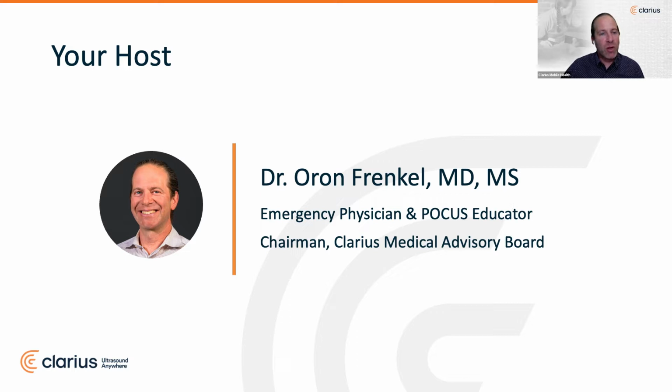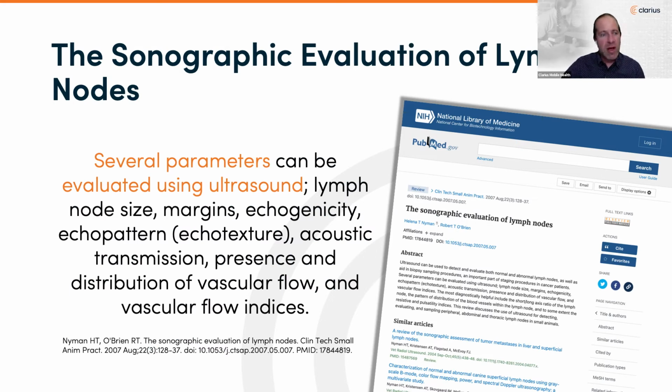To jump in, we're going to set the stage for today's discussion with a quick review of the literature. Start with an old review paper that shows what we'll discuss in this webinar, how ultrasound really is integral to the evaluation of lymph nodes, and not only to diagnose, but also to aid in the biopsy and further workup of patients. This is, like I said, an old review article, so I'm sure the ultrasound use has really penetrated into the veterinary practice since then, and it'll be interesting to see how that evolves.